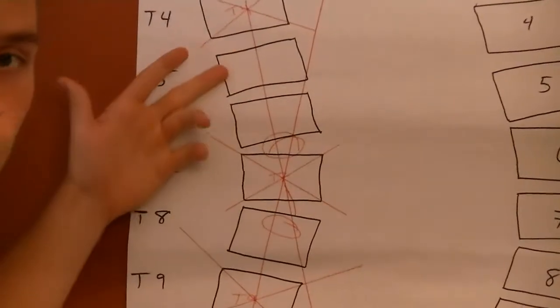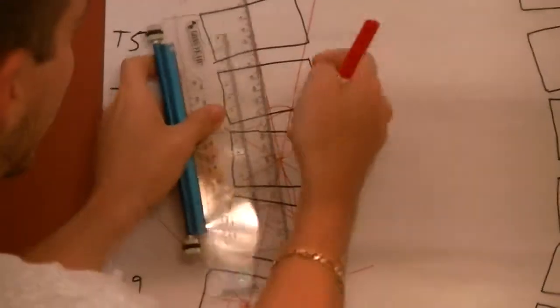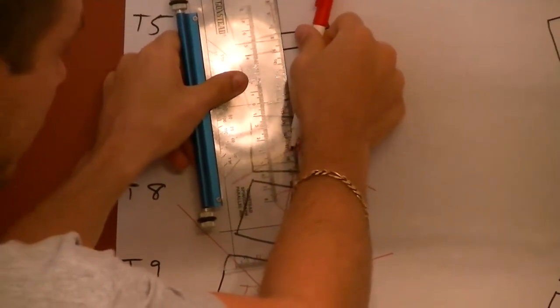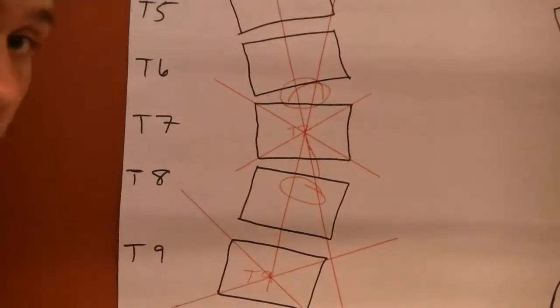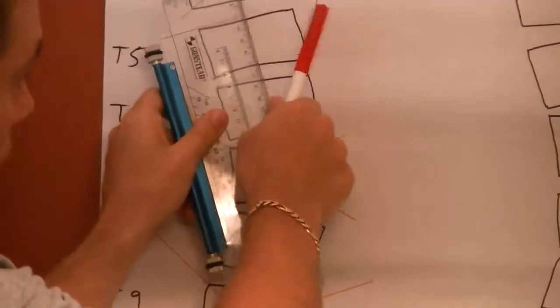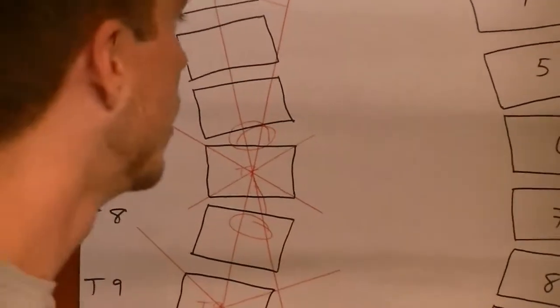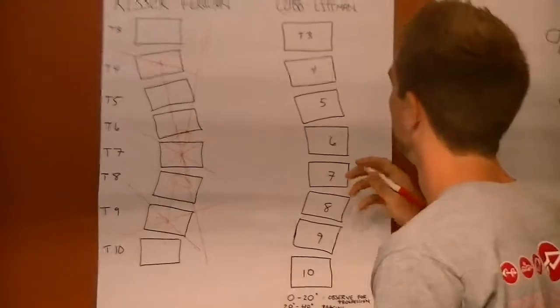This is a good one for the patients because you can actually see whether or not your scoliosis is getting better or worse. This has become a mess up here, but it's between these two angles. It's obvious for a patient: if this starts to get better and is more in line with a straight line, then their scoliosis has decreased. Or you can tell if it's gotten worse if that angle is getting bigger.